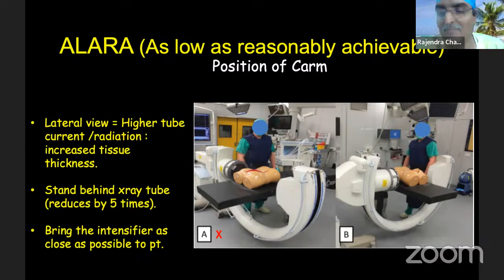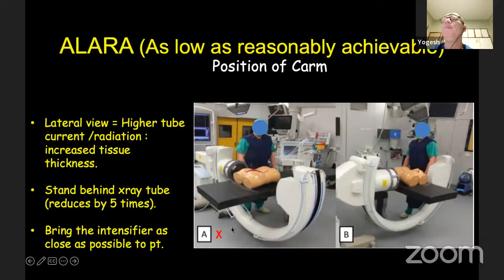No, but you are telling the same opposite principle which you have told in the previous slide. So basically, Sangeet, as per my knowledge and as per the slide also, hug the intensifier is the principle. The reason is whatever beam is coming, there is a radiographic plate here, and the beam is absorbed by the image intensifier. You are not worried about the direct beam because the beam is now collimated. Beam would not scatter beyond the image intensifier circle. I think we would need some clarification on this. Radiation will pass from the X-ray beam. We should not, I think, this is right, sir.